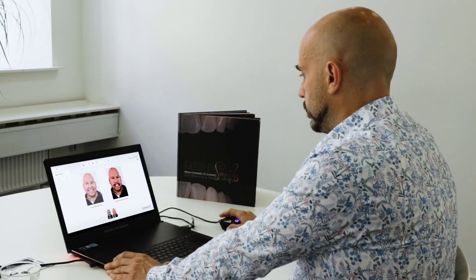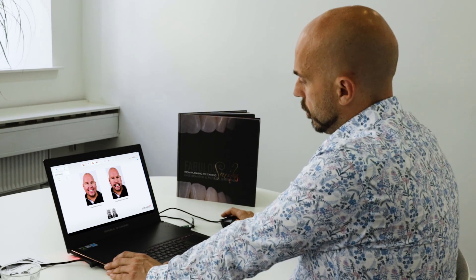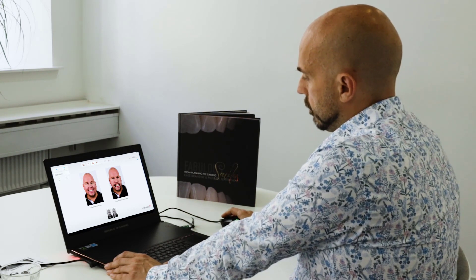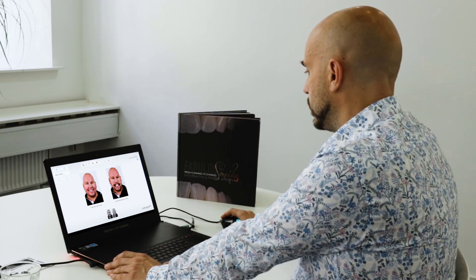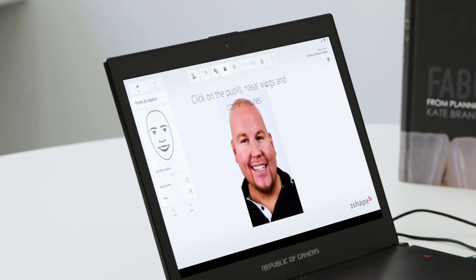These photos are very important for the smile design. You need a full face photo on the left and a full face retracted photo on the right. We press next and the software basically tells us what to do.